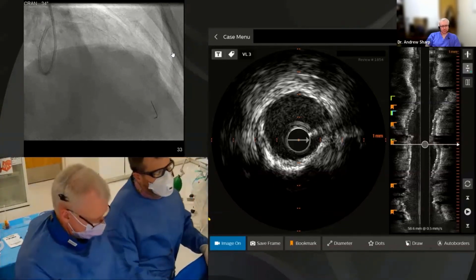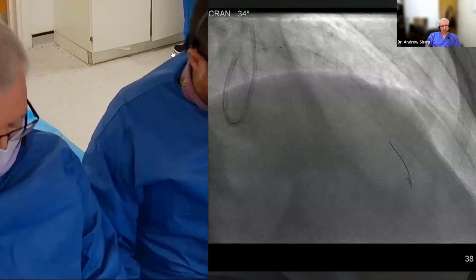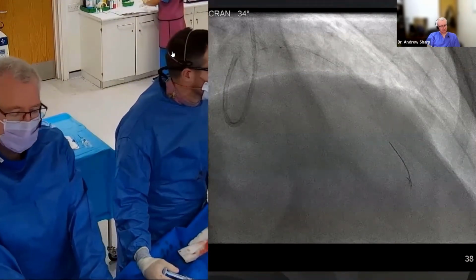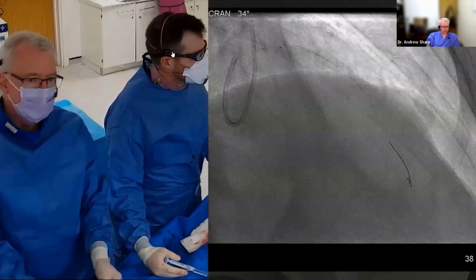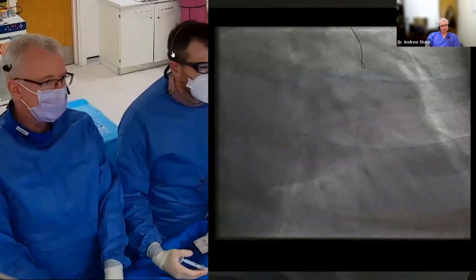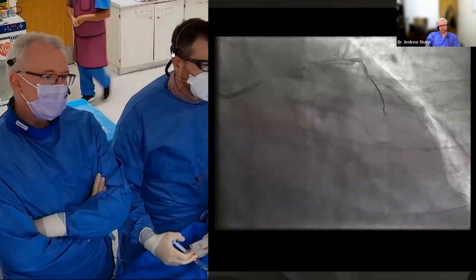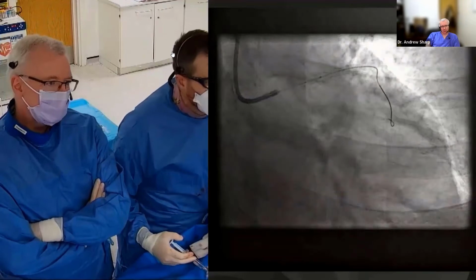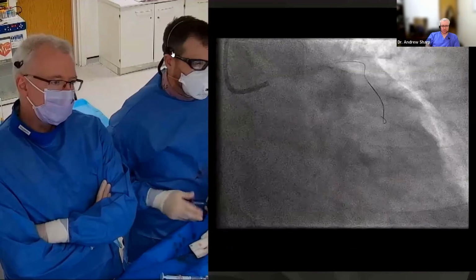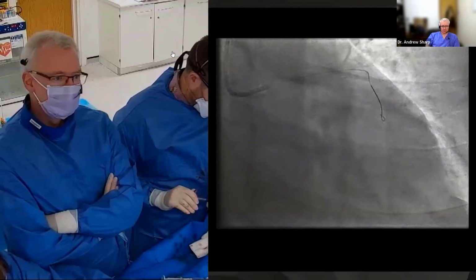Right, neg for me. And so again, we want to avoid, I mean, although the ostium of LAD was healthy, balloon injury at relatively low pressure is not likely to do much harm. We want to stay within the body of the stent. We don't have a 6mm length balloon in this diameter, so we've just got to make a best called judgment on whether we go slightly beyond the diagonal and accept that the septal is forgiving, or whether we go proximal to the stent and risk ballooning the LAD, or we take a different balloon. So this is perfect. It's right back at the ostium of the stent.